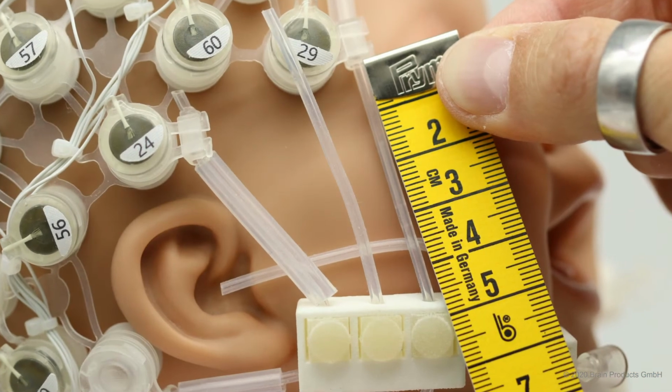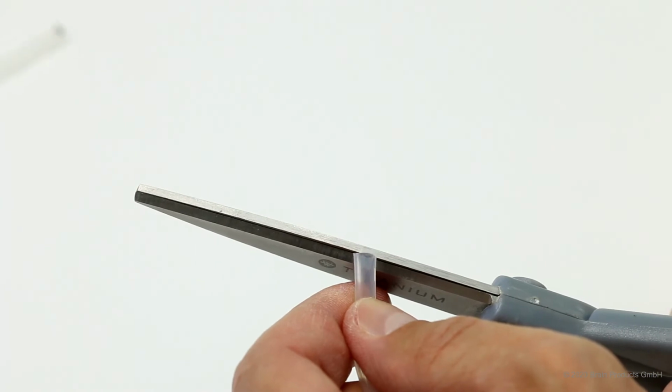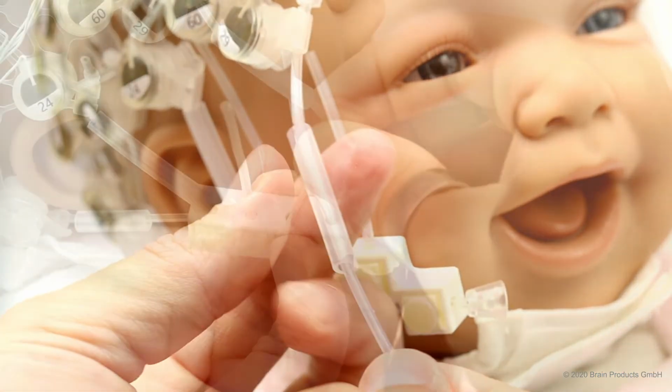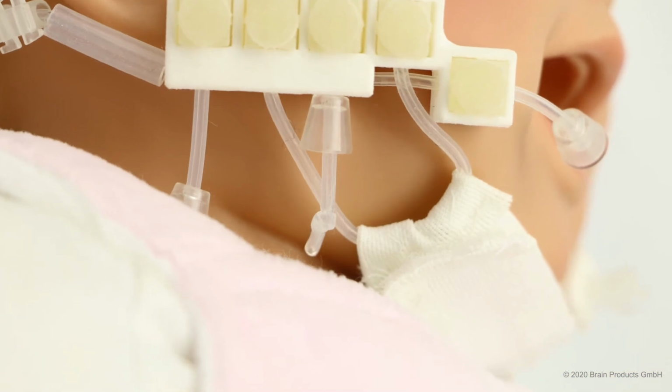Measure the length for the replacement tube. Mark and cut the tube. Slide the replacement tube over the cord. Insert the cord into the clamping block, put the cover on the cord, and tie the knot.